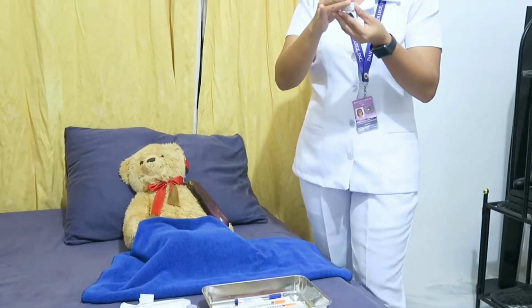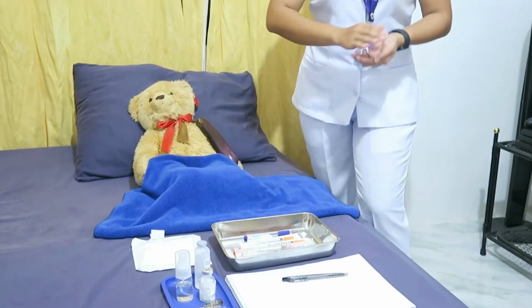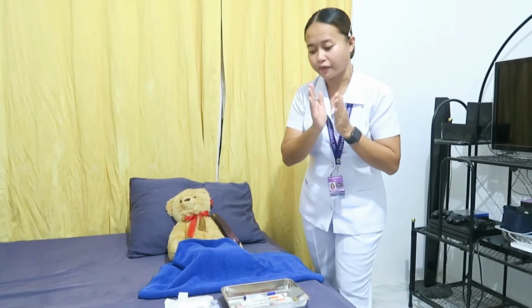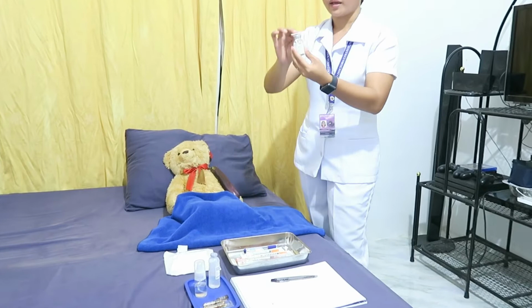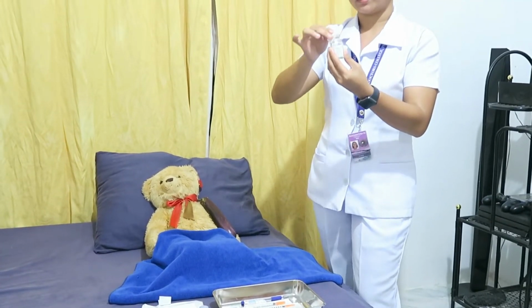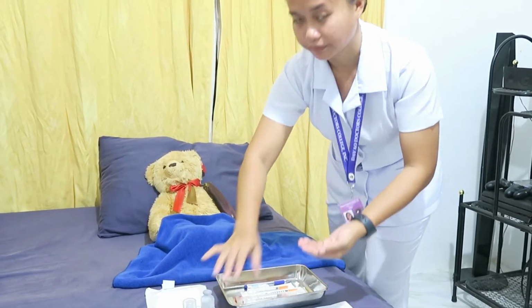As you can see, I've already removed the cap of the vial. After that, clean the vial with an antiseptic wipe by rubbing in a circular motion. So let's proceed to the next procedure. The next procedure is to withdraw the medication.